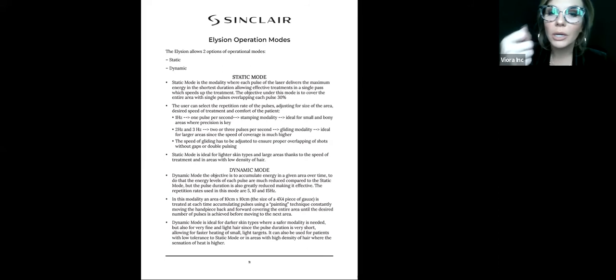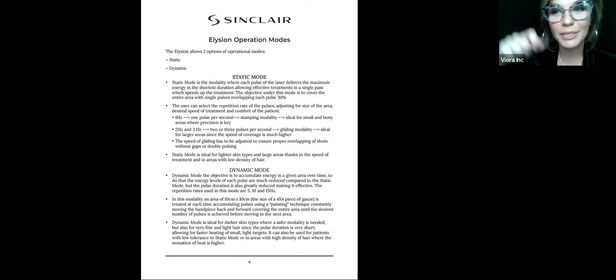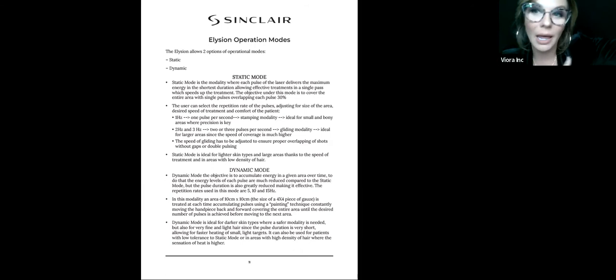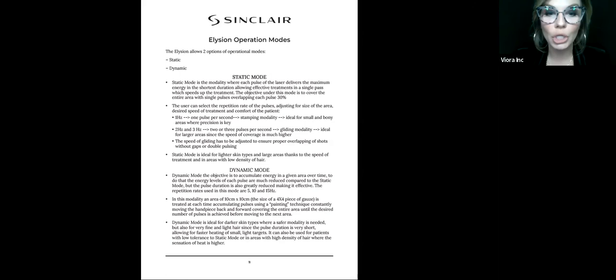So 2 hertz and 3 hertz, 2 or 3 pulses per second, is a gliding modality. All you do is hold down the trigger and glide, overlapping by 30%. At 2 hertz, you glide slower to make sure you're really watching and getting that 30% overlap. Sometimes people go too quickly and miss a lot of areas. At 3 hertz, you're gliding faster, still watching for that 30% overlap. I would say 2 hertz isn't used too much, unless you want to glide a little bit slower. 1 hertz and 3 hertz are going to be your most used.